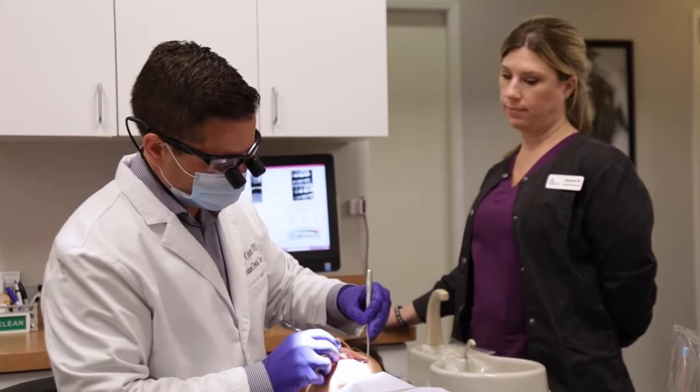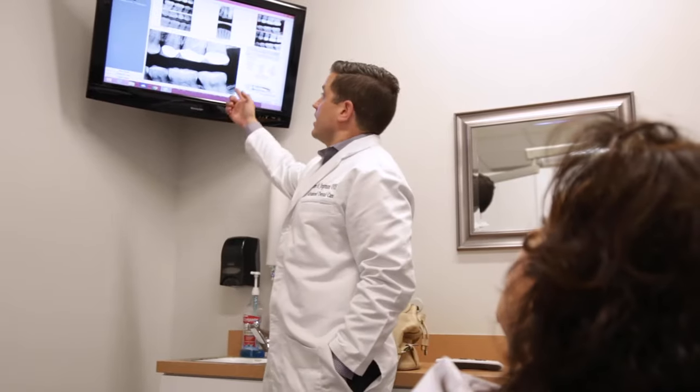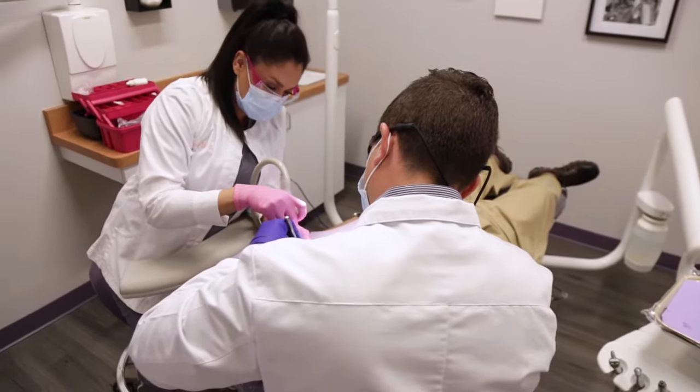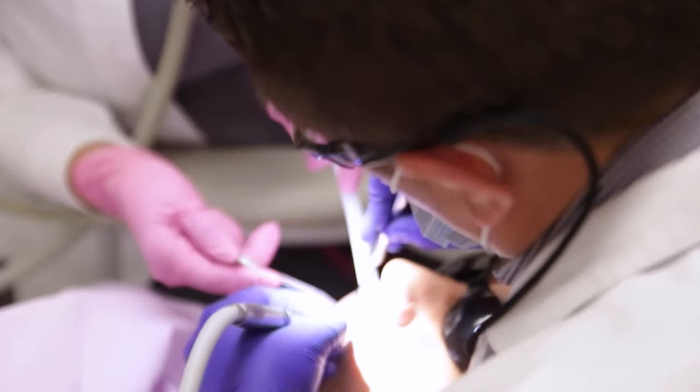An implant is a great option to replace missing teeth because it's all one prosthetic device. There is no natural organic material, no tooth that can still get decay. It's also an individual tooth, so you can still floss and clean properly around it, compared to a bridge which involves other teeth.